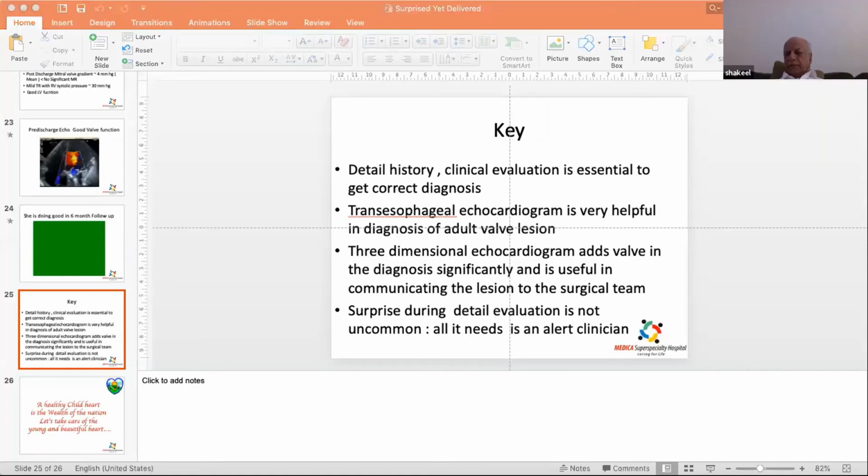In paravalvular leaks, Anil, we do catheter closure both transeptally and transapically, retrograde arterial, but we do not do any of them without 3D transesophageal echo assessment.